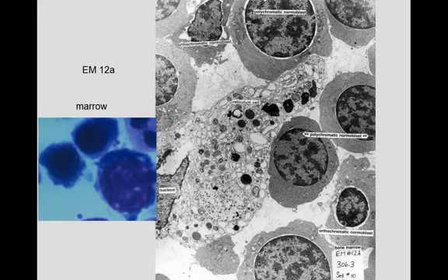These cells are polychromatic because they still have ribosomes and hemoglobin is being added, hemoglobin being pink, a ribosome being blue. That makes them polychromatic. As you get on down further, the ribosomes have been reduced, and you have the orthochromatic normoblasts like we see here and here.